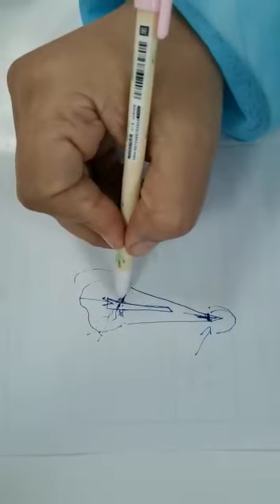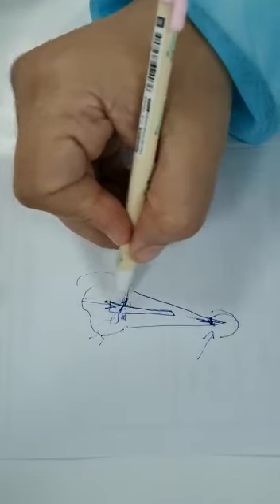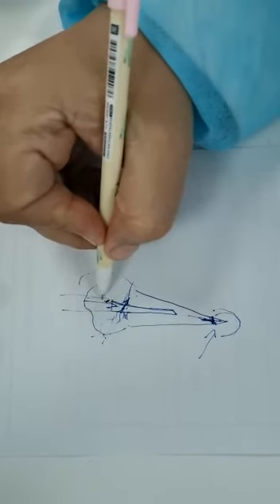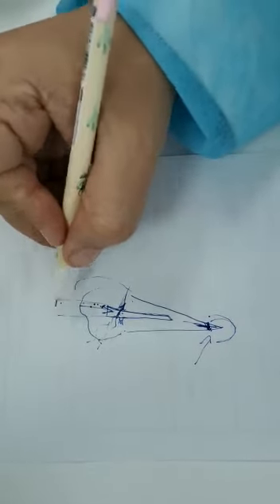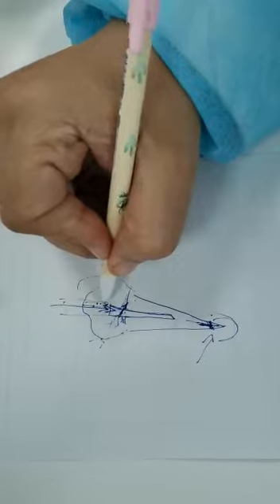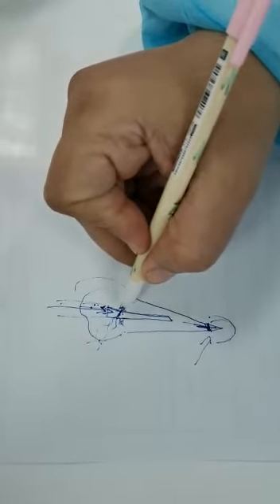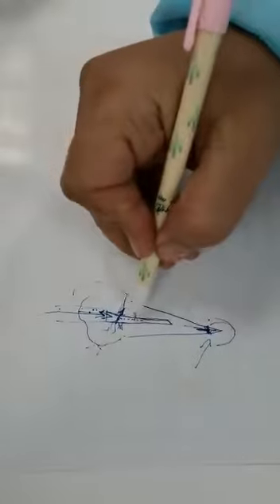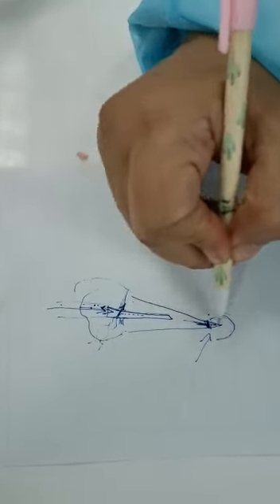So if we're going to remove it coronally with a burr, you're going to use the burr under a microscope. If we don't have a microscope here in the prosthodontic department, they have one in the endodontic department. So you refer them to an endodontist, and the endodontist removes it under microscope supervision. They have minimal size instruments, they go into the post space and remove it gradually under the microscope, ensuring that they're not going laterally here or here. And then they also do the endo.